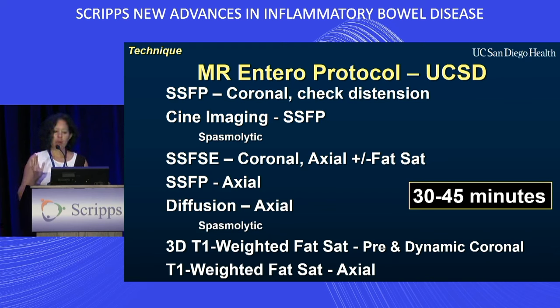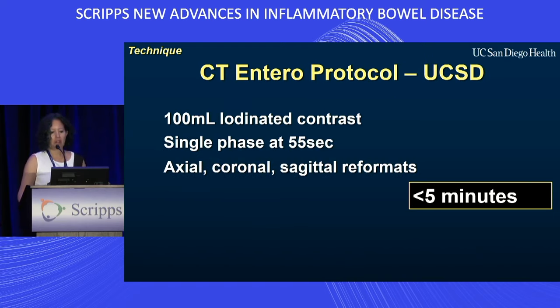Most patients are okay with staying on the table the whole time. We'll have the occasional patient who needs to get up to use the bathroom because the oral contrast agent that we use does go through the bowel quickly, and once again, it is a large volume. And this is another thing that's good to tell your patients. You wouldn't want your patient coming in to get an enterography and then planning to sit in a car for 4 hours driving to Arizona or something, because that's not going to end well. They need to have access to a bathroom and be aware that that may be an issue. There may be some cramping involved as well. So 30 to 45 minutes for an MR enterography.